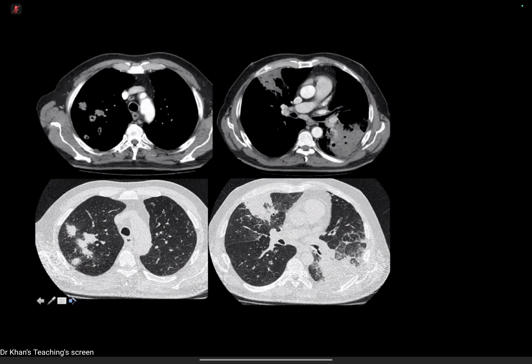So the appearances are of bilateral pulmonary malignancy with mediastinal lymph nodes. There is apparent pleural involvement, and there is involvement of at least both lungs. So this would be a relatively high-stage tumour. I think T4, but I'd have to check the TNM classification for the likely malignancy.